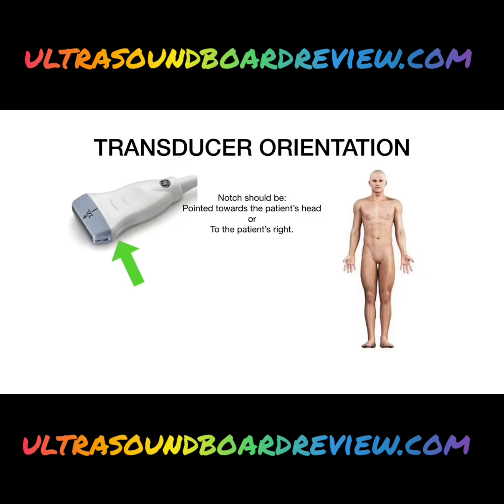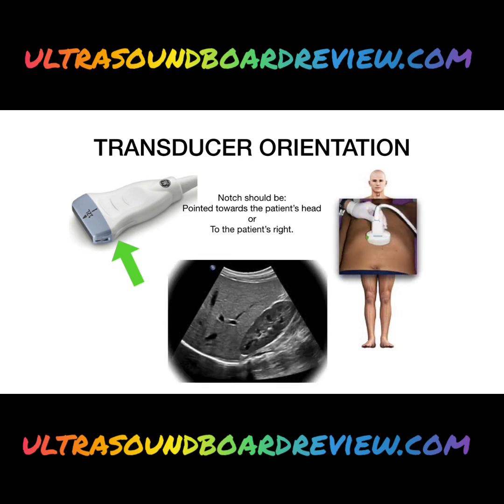Flow direction, like ultrasound, is operator dependent, so make sure to watch your notch. For this tutorial, we're just going to assume that whoever's watching is using the widely accepted transducer orientation, the one with the notch either towards the patient's head or to the patient's right. Not following this orientation will mess up your flow direction. So make sure to use extra caution when you're scanning out of your element, like when you're scanning left arms, scanning bedside, scanning backwards. It's really easy to get that notch flipped around and not realize it.